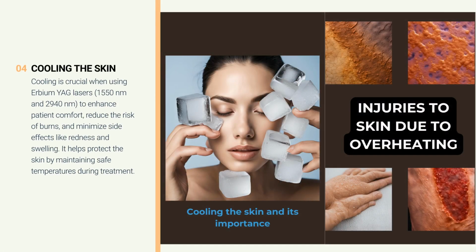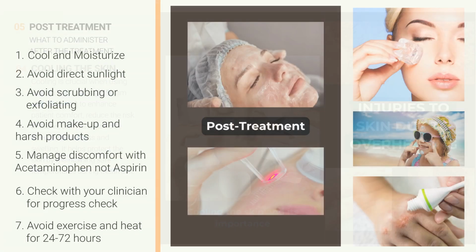Cooling is very important when using erbium lasers, as it helps protect the skin, minimize discomfort, and reduce the risk of thermal injury or burns. Cooling during laser treatments can also improve patient comfort by numbing the treated area, minimize side effects such as redness, swelling, and potential blistering, and enhance safety by lowering the risk of overheating the skin during more aggressive or high-energy treatments.